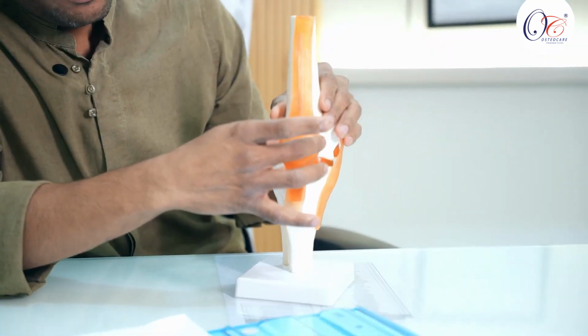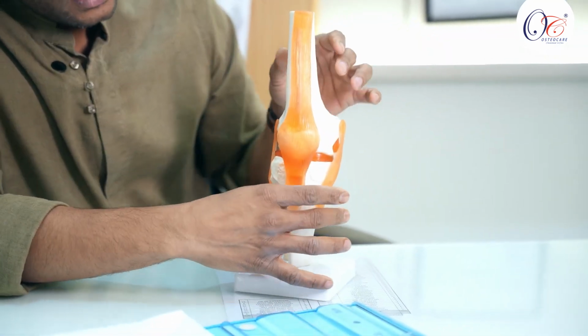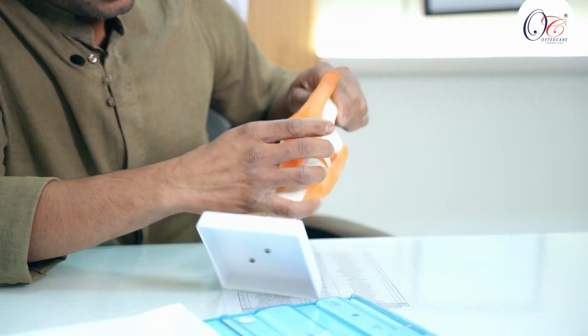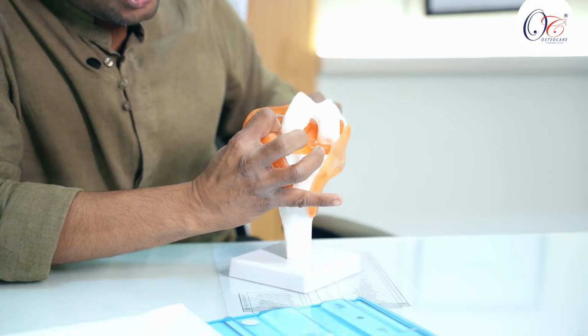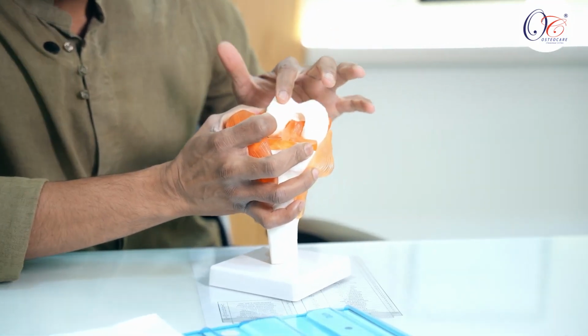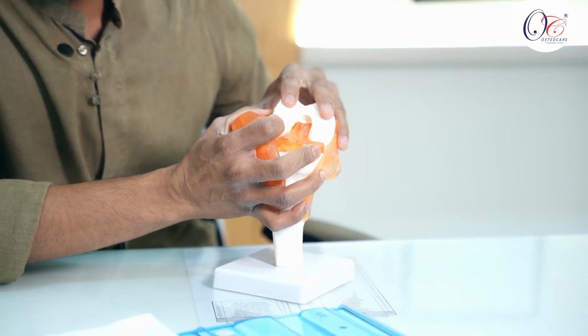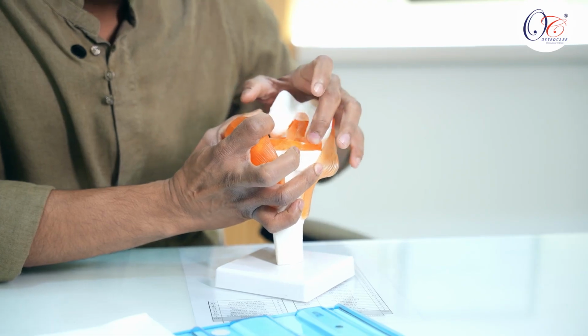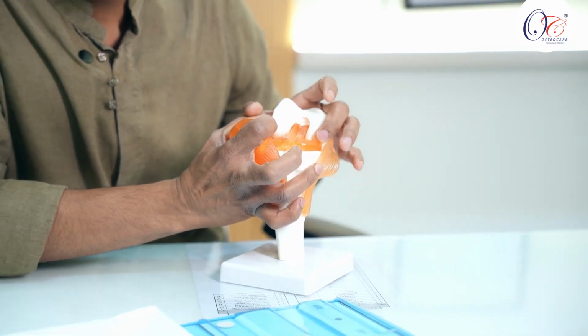So this is our normal knee joint. This is the patella bone, this is the thigh bone, and this is the leg bone. Between the two bones is our knee joint. When we see inside the knee joint, this is called the cartilage. This cartilage is very important for the normal functioning of the knee joint. These two C-shaped, curved structures are called menisci.